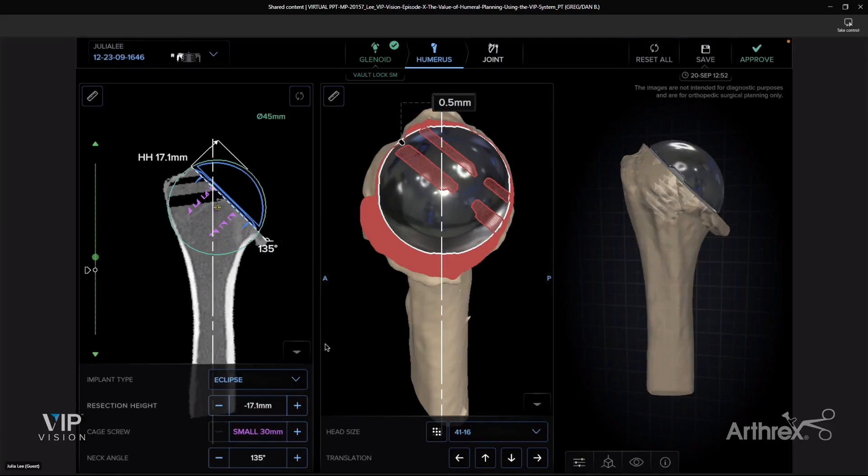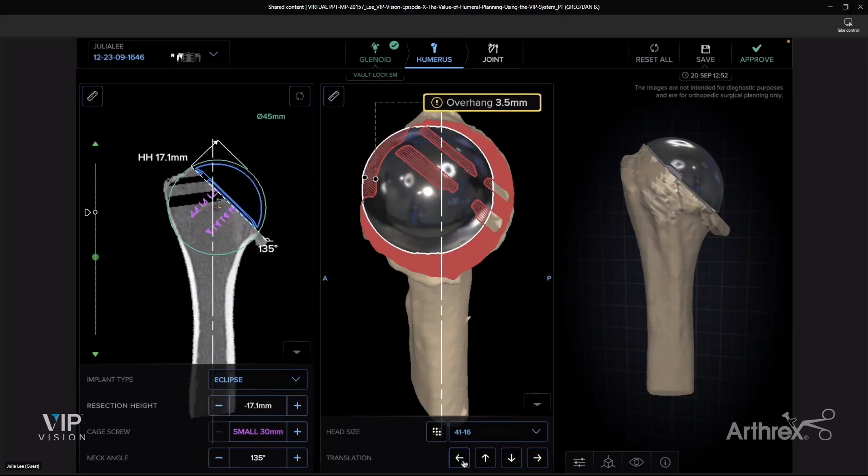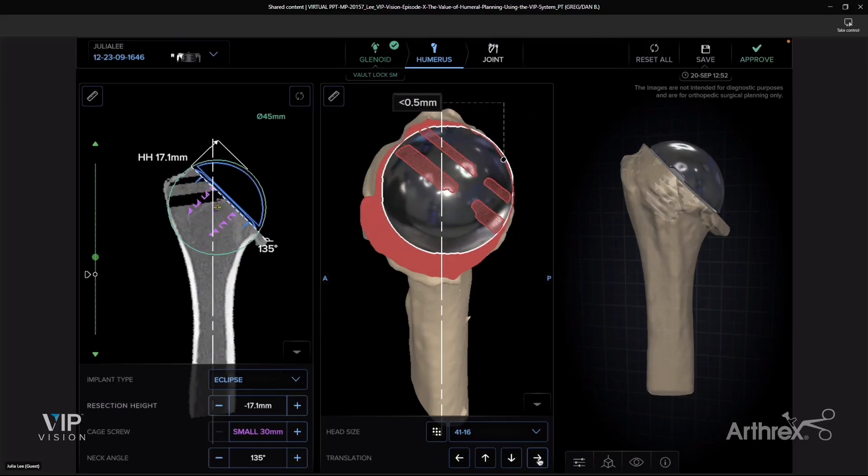Coming back to this particular image, you can also look at the cage screw. The cage screw function shows where the cage screw is — this is a small that's in there now. Going up to a medium looks okay, but you certainly do not want a large; if you've perforated the cortex at all, you'll get a warning message and want to size down. I think a small component looks pretty good there. Looking in the middle, you can do an anterior-posterior translation, which will tell you if you're overhanging the humeral head too much anteriorly or posteriorly. I think this sits very well — the recreation looks great, center of rotation is restored very nicely. Just remember to take off the osteophytes at the time of surgery.